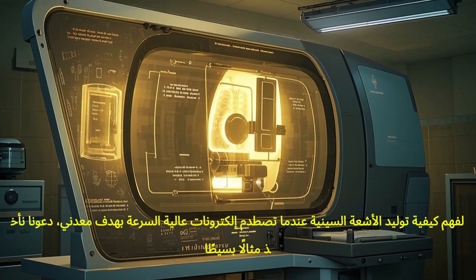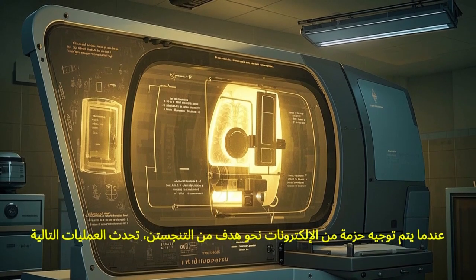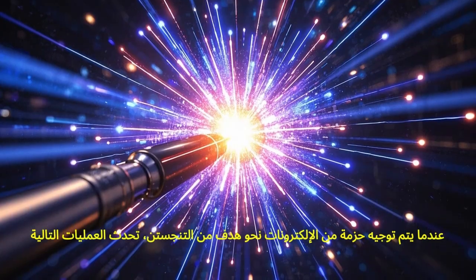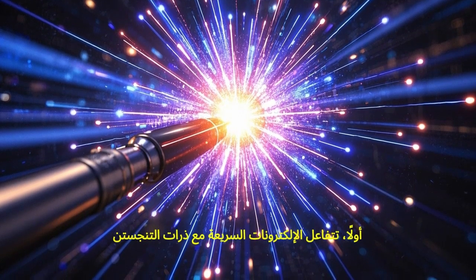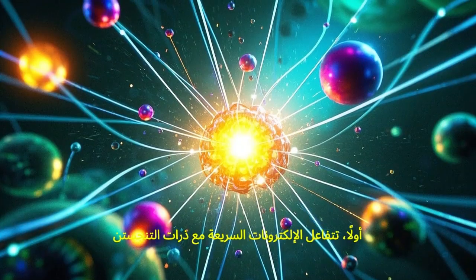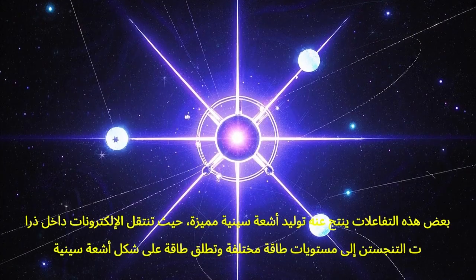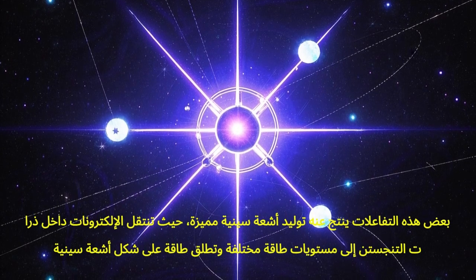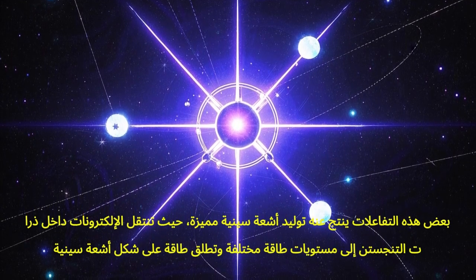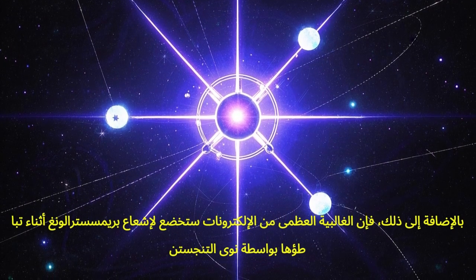To understand how X-rays are generated when high-speed electrons strike a metal target, let's consider a simple example. When a beam of electrons is directed at a tungsten target, for instance, the following processes occur. The high-speed electrons first interact with the tungsten atoms in the target. Some of these interactions result in the production of characteristic X-rays as the electrons in the tungsten atoms transition to different energy levels and release energy in the form of X-rays.